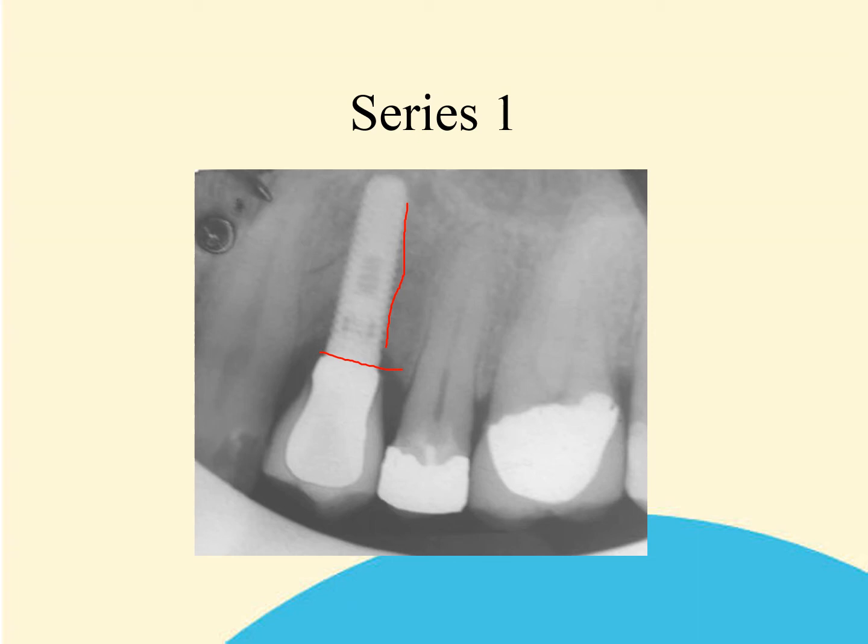of connection. So this is our standard early implant design, and the office will be able to help you with the components for this, and you will see that there is a presentation about how to go about taking a transfer impression related to this type of interface. So this is our standard early interface.